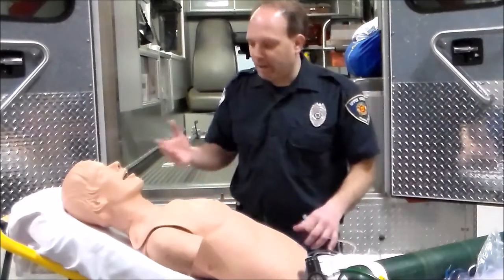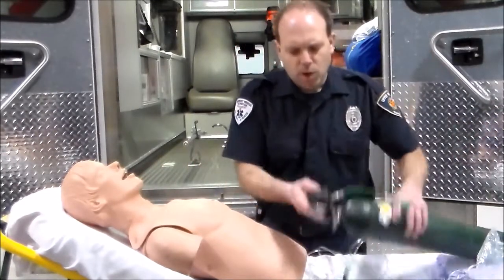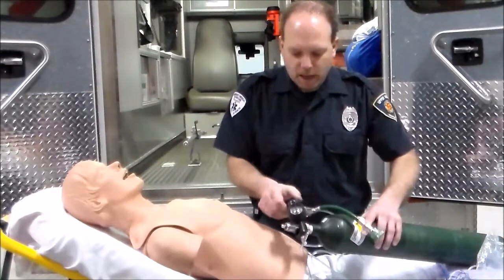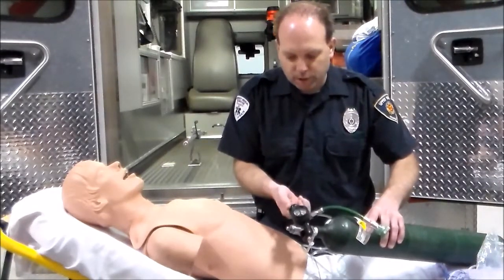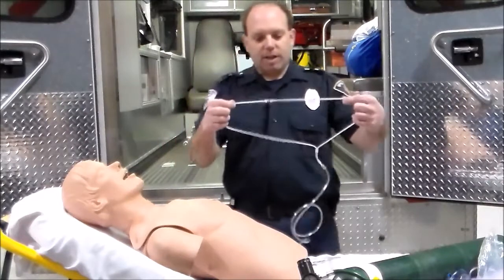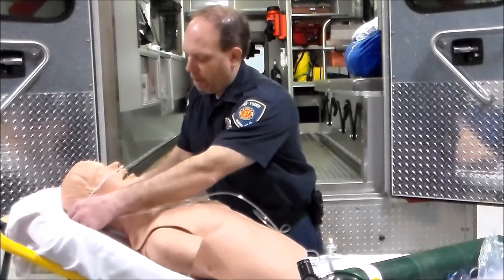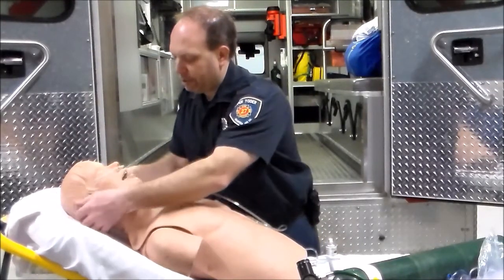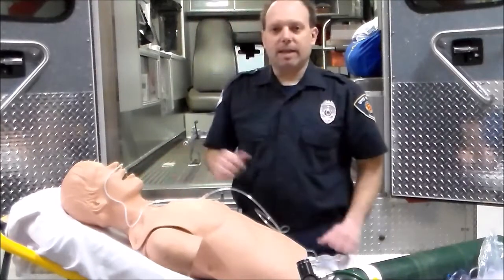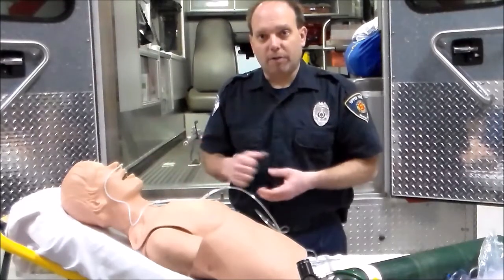First, we explain to the patient that we're going to place them on oxygen. We've turned on the oxygen cylinder. I'm now going to connect this to the tree at the bottom and adjust the flow to four liters. I now have oxygen flowing through here. I'm going to apply the nasal prongs to the patient's nose. The patient here doesn't have ears, but after placing the nasal cannula in, we wrap it around the ears in the back and tighten it for comfort — not too tight underneath the neck.